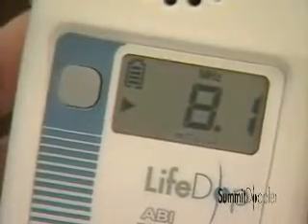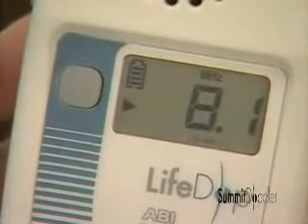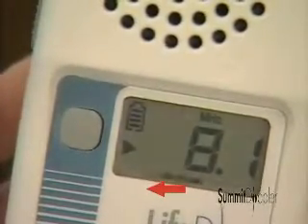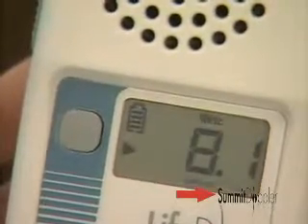This is a triphasic signal from a healthy patient. Observing the signal bars will help you to visualize the flow. Flow toward the probe, in this case forward flow, is shown by bars to the left. Flow away from the probe, reverse flow, is indicated by bars to the right. This is typical of a normal triphasic waveform. Note the forward, reverse, forward sequence.